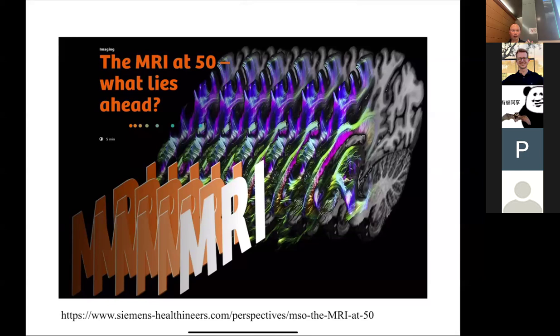Then the other issues are, for example, what we've talked about: when the gradients are switching, they can induce dB/dt, which then can go on the wires, right? So you can think of clever designs where you can cancel out the dB/dt, for example. So there are ways of getting around that. And there's also heating of the wires. On the device design, maybe you go to carbon fiber wires or something like that, where there's less heating of the wires. So there are things you can do on the device side.